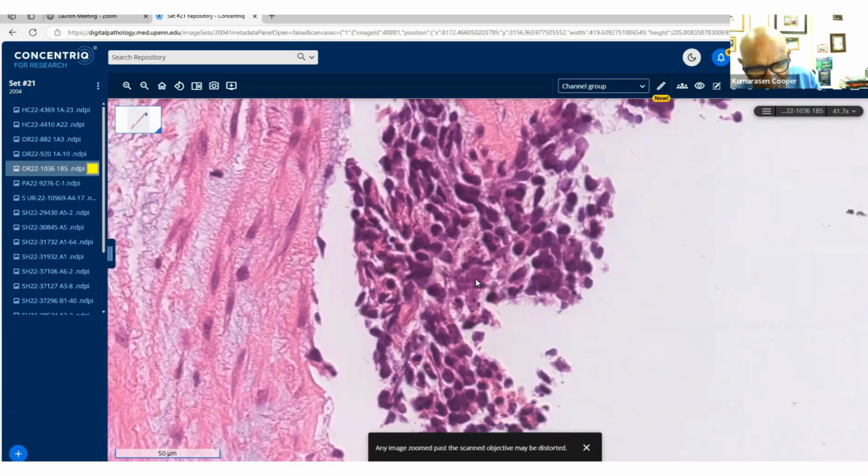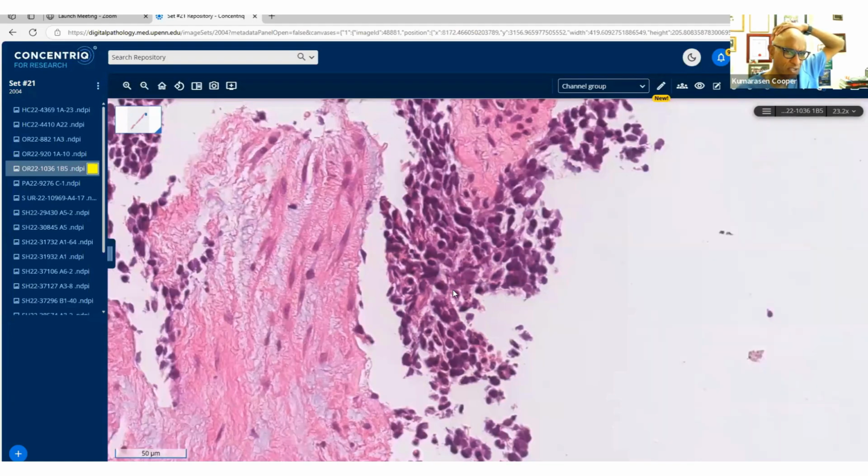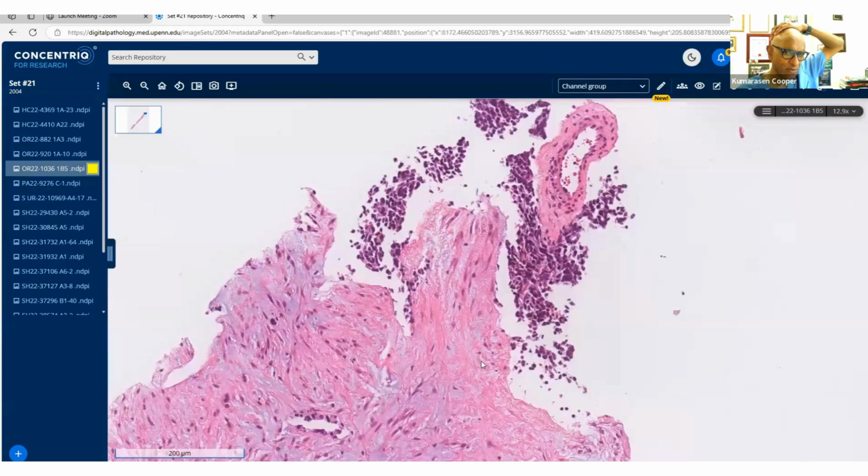Desmin dot-like immunoreactivity, and they also have keratin as well. Now, in the old days, they used to say that NSE was positive, and that was the marker that was used to say that it was polyphenotypic, because you had epithelial, muscle, and then what was known before as neuroendocrine. I mean, we don't believe that NSE is a neuroendocrine marker anyway, but that's the historical perspective of these tumors. I think the Desmin dot-like immunoreactivity is very useful.